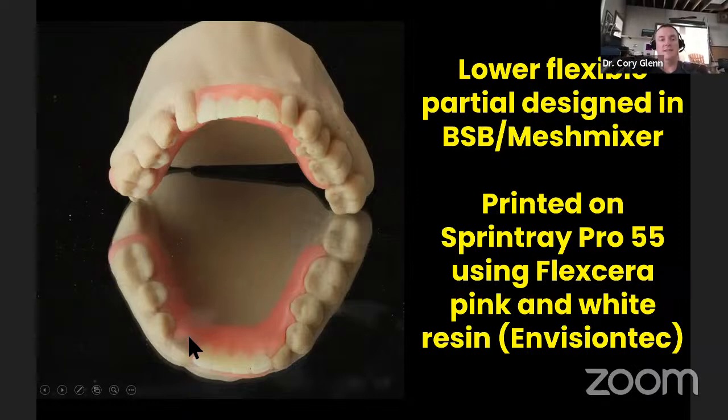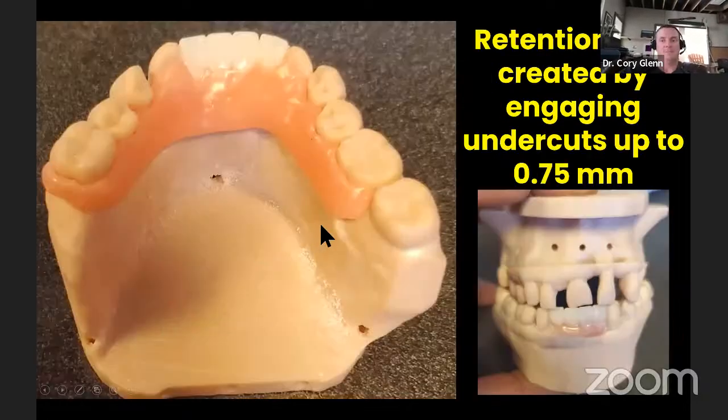And I really like doing these. They actually, to me, I like them better than a, say, a Valplast or a Duraflex or something. They're much easier to adjust on without looking all ratty and creating those burred up heat marks. They're obviously almost free to make. So anyway, I really like these. That's a good resin to try if you want to make those.